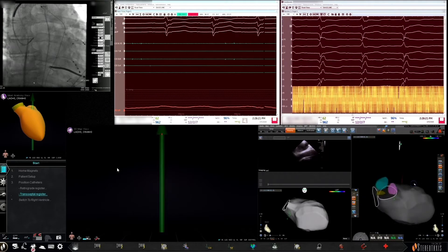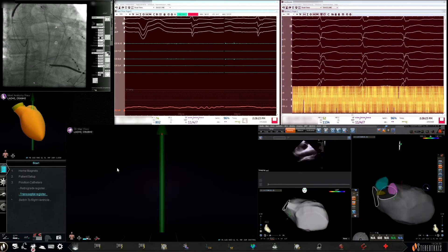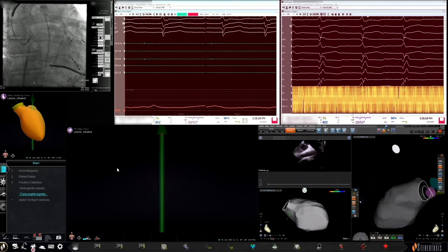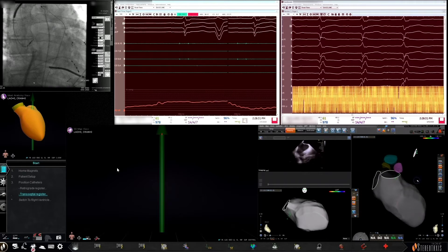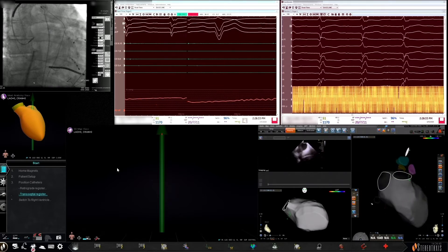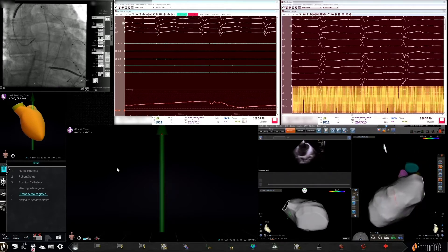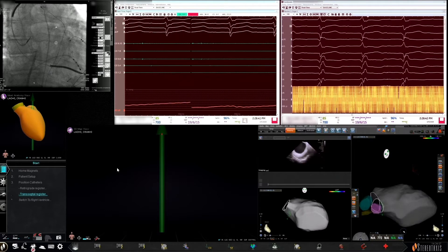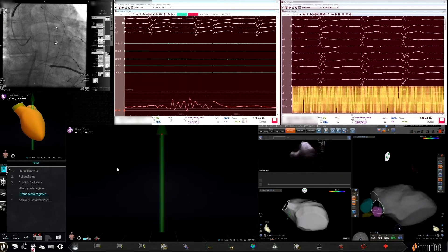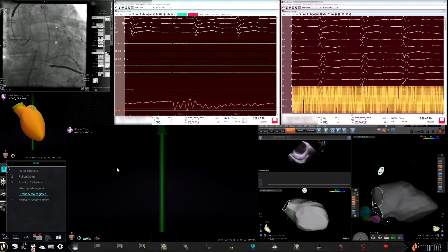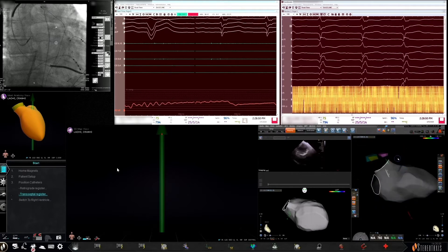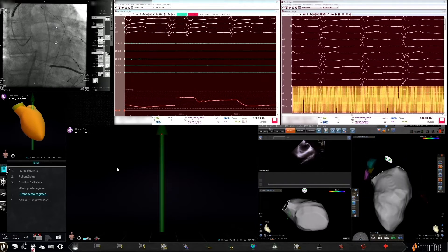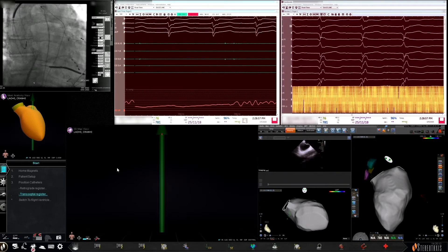Transeptal access was then performed with the use of ICE and fluoroscopy guidance. The approach in this case was somewhat posterior, with imaging of the pulmonary veins seen during transeptal access. While a manual catheter may require guiding a more anterior or posterior approach, with the use of a navigation system this becomes less important — with the one caveat being that a somewhat high transeptal can sometimes impede mapping as the Agilis sheath can be driven upwards while mapping.